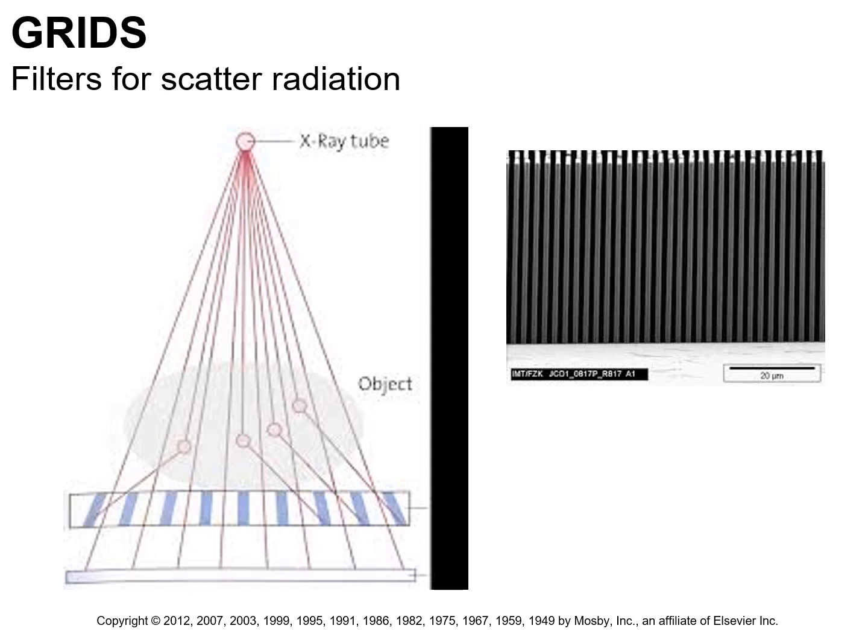Okay, the image receptor is that little rectangle at the very bottom of the picture. Okay, the grid is the thing with alternating blue stripes in it. The blue stripes are basically slots of lead oriented in the same geometry as the primary X-ray beam.